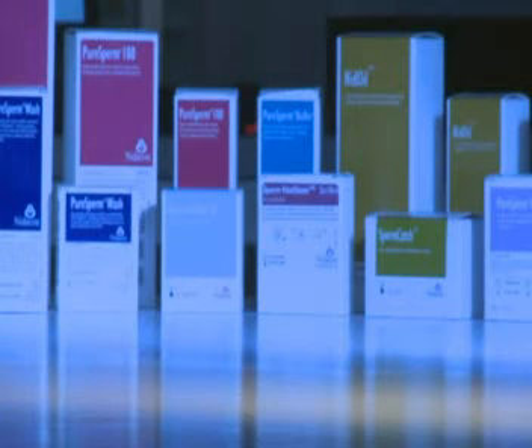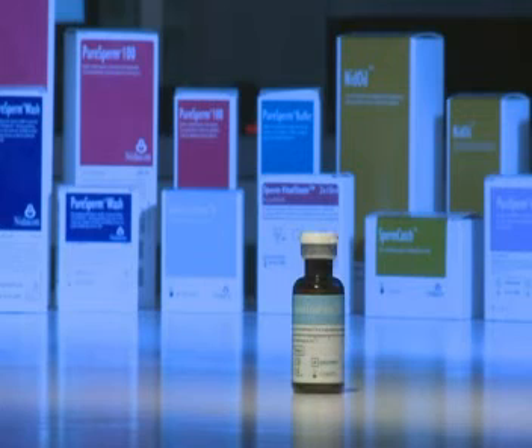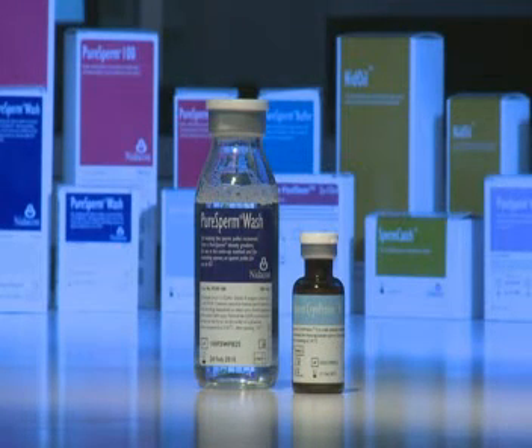To freeze sperm using Sperm Cryo-Protect 2, you need Sperm Cryo-Protect 2 and after thawing, pure sperm wash will be needed. Sperm Cryo-Protect 2 can be used to freeze prepared or unprepared sperm. We recommend freezing prepared sperm for a better recovery rate.